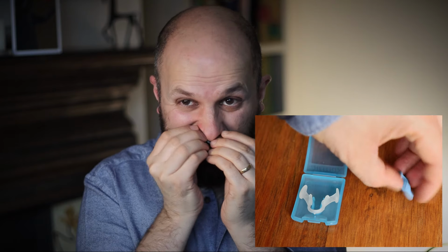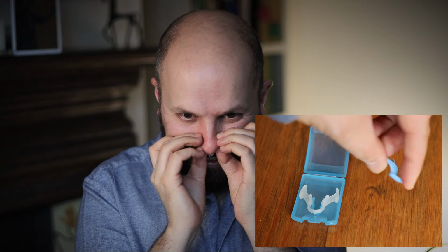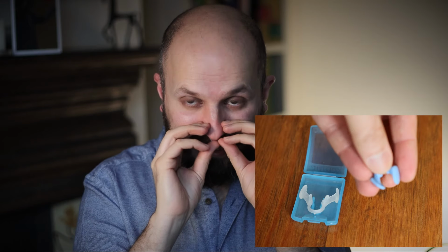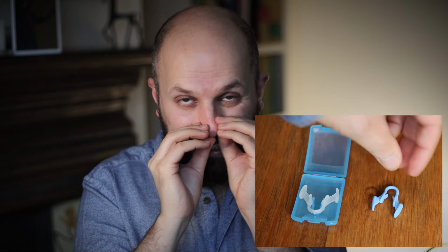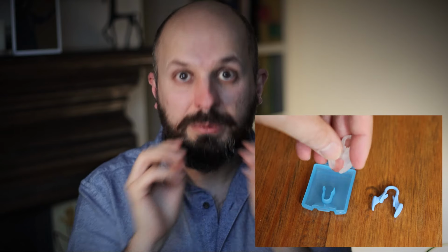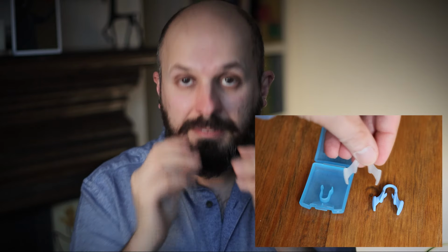nose that way. If I put it in my nose like this, it's a little bit more fiddly than the other ones. Again, you have to get it past that cartilage, which is down the side here, and you'll feel that it just goes past, and once it's in the right place, it suddenly feels a bit more comfortable, and you can breathe a bit better. I think, for me anyway, this feels like I can breathe a lot better through it. So these work quite well.